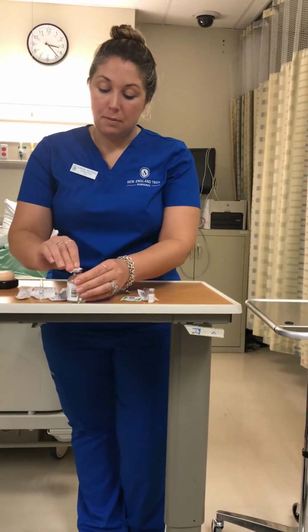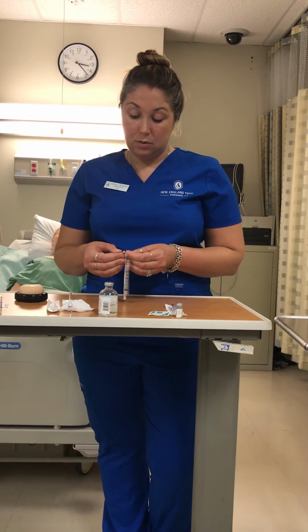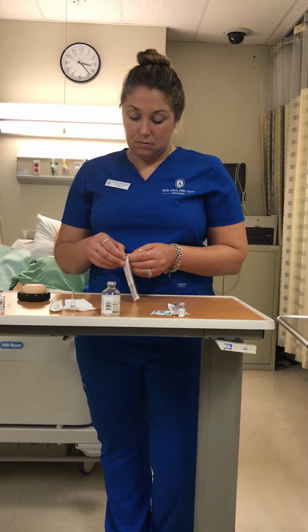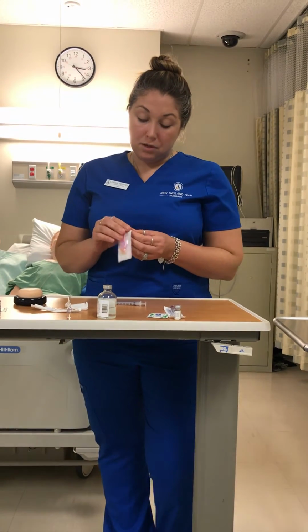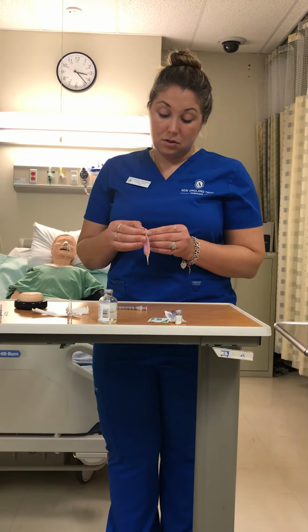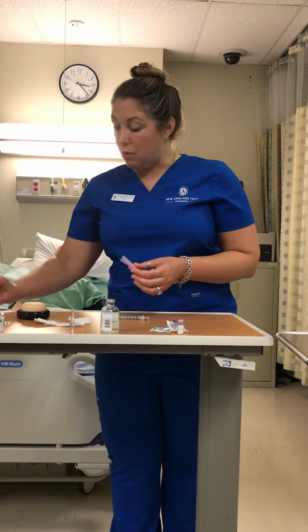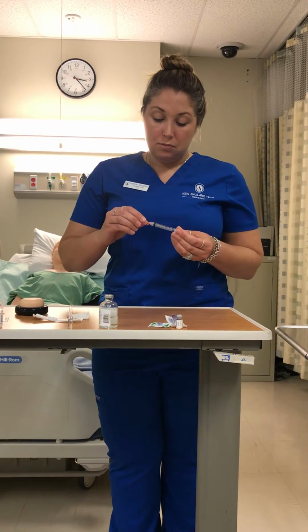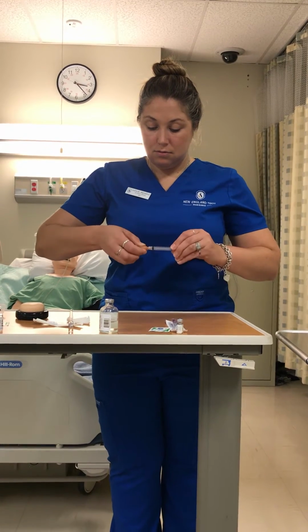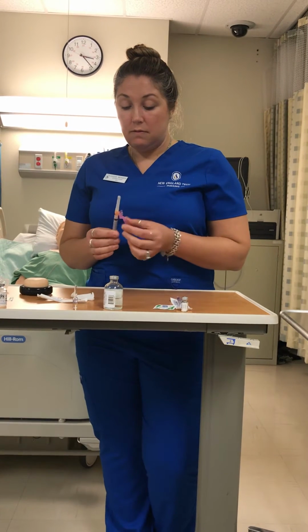Rip this open, wipe the top of the vial. Needle with the plunger. And like I said before, depending on the size of the patient, you would have to use a larger needle or a smaller needle. Usually you go with a 25 gauge, 5/8 inch. This one you push on and screw on. This one has the safety feature, so once you're done with the needle, this covers the needle immediately. The same thing, flip this back.